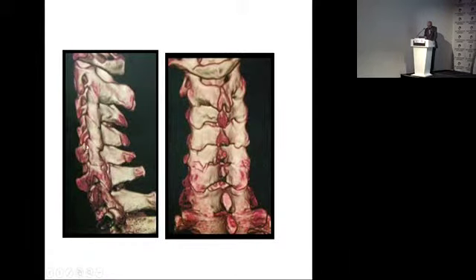Facetal listhesis. Facetal listhesis is the issue in spinal degeneration. We introduced facetal distraction spacers, and this, for your information, is a technique which has been patented by me, the implants which have been patented by me. So there is some kind of a patent involved, but patent is patent, theory is theory, and philosophy is philosophy. I want to discuss philosophy.